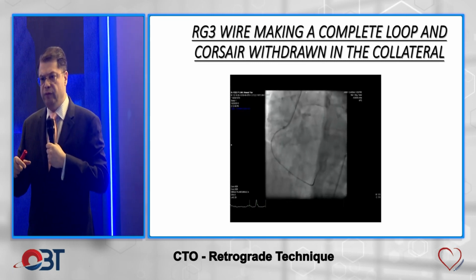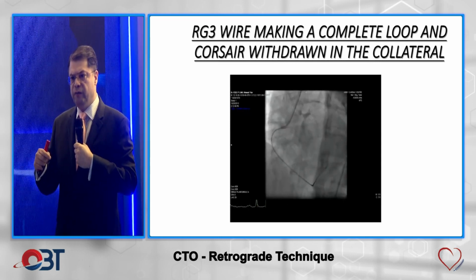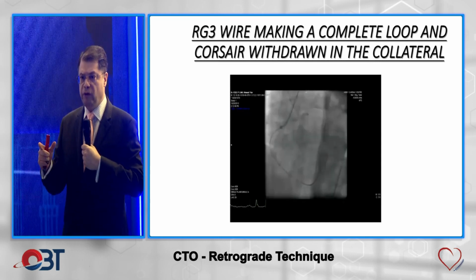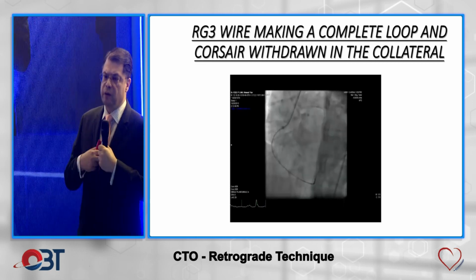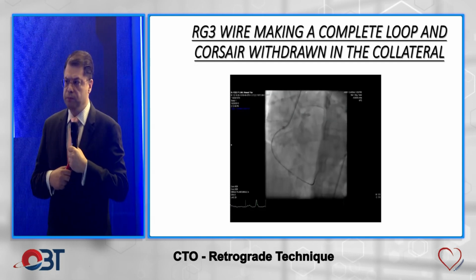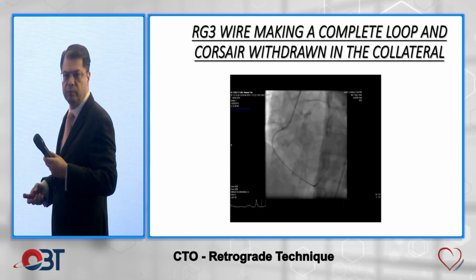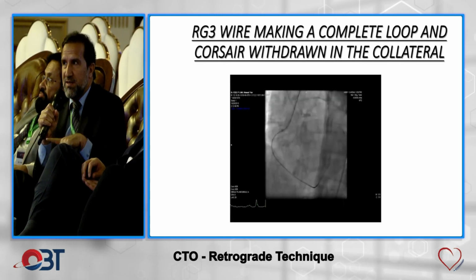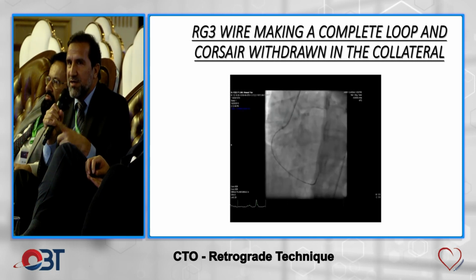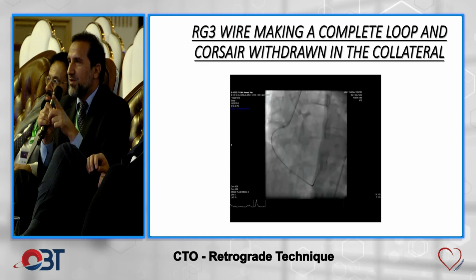The only downside of the retrograde approach is that it has a steep learning curve and it has more chance of complications. 5 times more chances of complications as compared to the antegrade approach. Once I read a case report of septal hematoma that led to internal tamponade, and they had to drain the hematoma into the cavity by puncturing it.